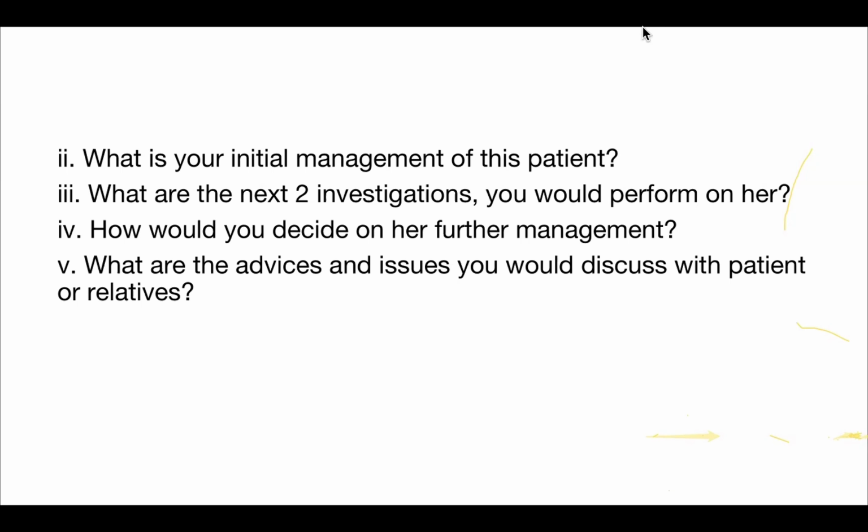And you should know how to do cardioversion. Sometimes they might expect you in your OSCE if there's a CPR station. So you should connect the patient to the defibrillator, not the normal monitor, and then only the defibrillator can differentiate. And you have to push the synchronize button. So those are the two prerequisites. Connect the patient to the defibrillator by ECG and then push the synchronize button. If you do those two things, the machine will do the cardioversion, otherwise it will always do the defibrillation, right? Okay.